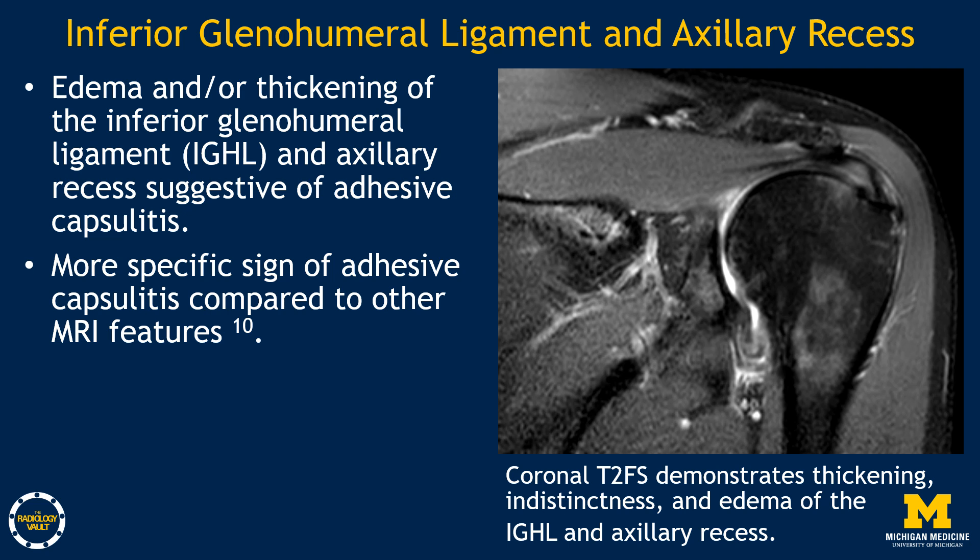One area to look at on the shoulder MRI is the inferior glenohumeral ligament and the axillary recess. If you see edema and/or thickening of the inferior glenohumeral ligament and the axillary recess, this can be suggestive of adhesive capsulitis. Note that this is a more specific sign compared to some of the other MRI features. Here, we have a coronal T2 fat-saturated image demonstrating thickening, indistinctness, and edema of the inferior glenohumeral ligament and the axillary recess as annotated by the arrow.